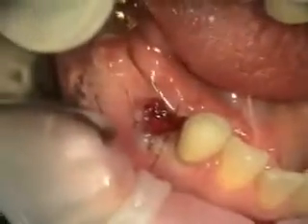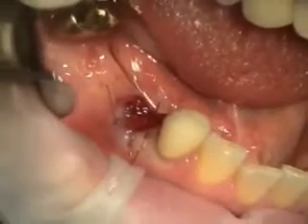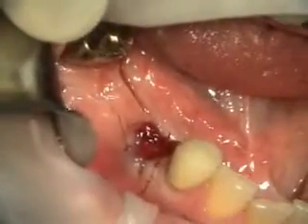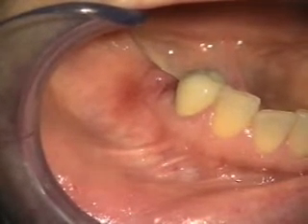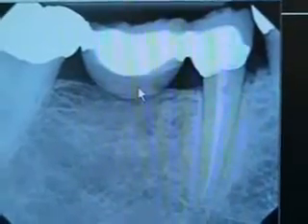We already know we have adequate keratinized tissue so I'll just use that later. We're going to make her a lower retainer just to keep things from shifting. We've already made a model of the lower. This is a two-week healing of the extraction and bone graft for number 29, and she's wearing a Trutane retainer just to hold the space. Here's where we started, and this is what it looks like now — we'll be checking it out in two months.